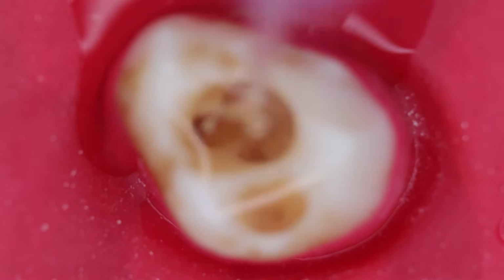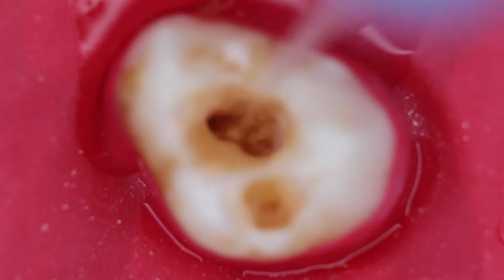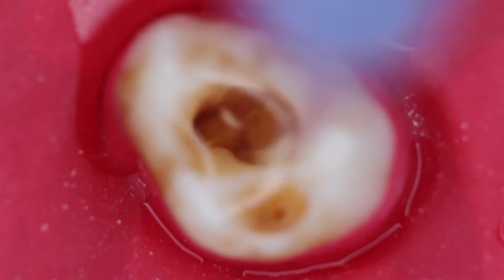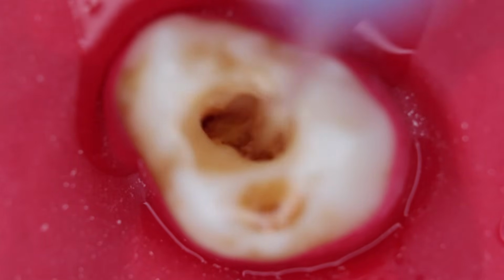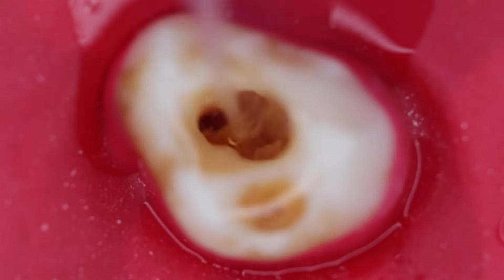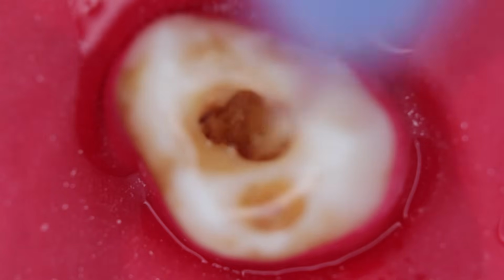See the debris that are coming out, because these are the dentinal debris. This is the time you can use the saline. Doctor, I am using the GG drills. If you don't have the orifice opener or the orifice enlarger files, you can use the GG drills to enlarge the canal orifices, when you are not using any microscope in your practice. At that time you need to visualize the canal properly so that you can work on it. See the debris that are coming.